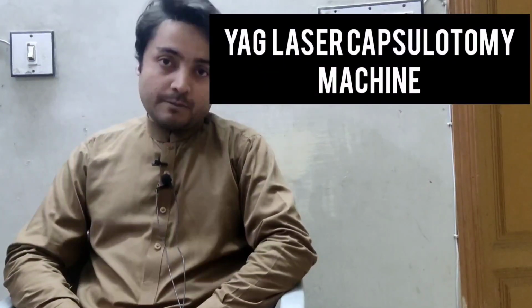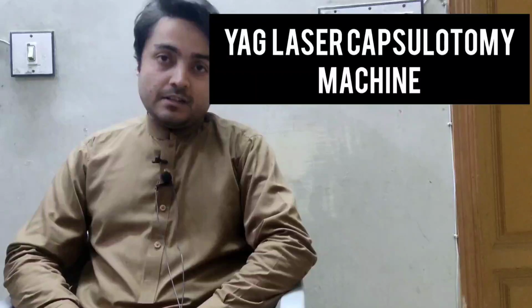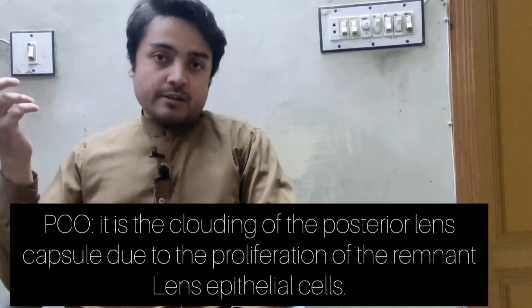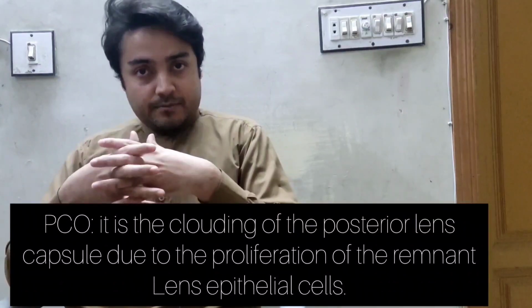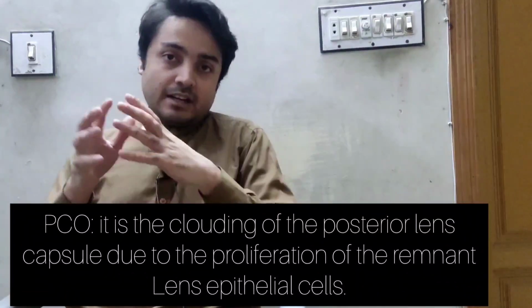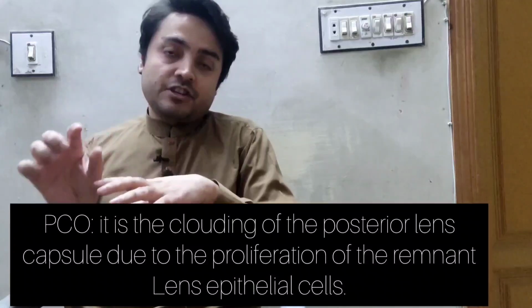So guys, this equipment or this machine that you just saw, this is known as YAG Laser Capsulotomy, and this is used to treat posterior capsular opacification. So let's first define posterior capsular opacification. In cataract surgery, as we discussed in my previous videos, the lens capsule is left intact. We make an opening in the anterior lens capsule through which an artificial IOL is implanted.